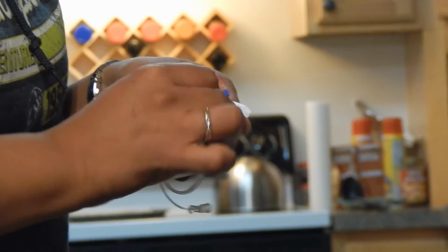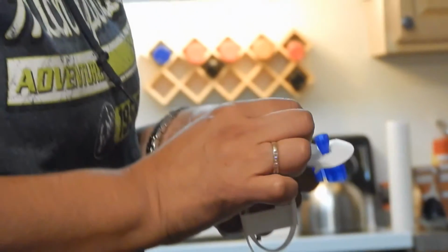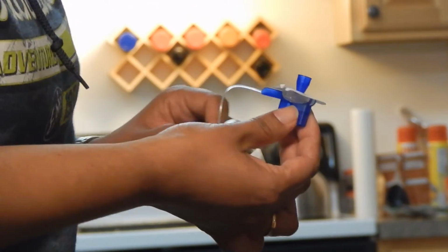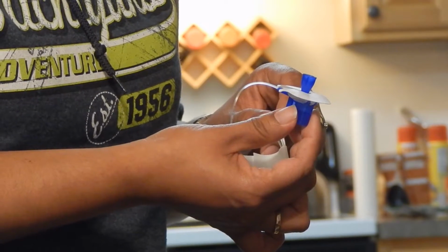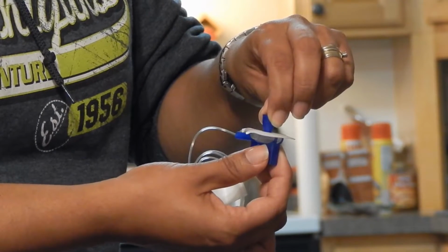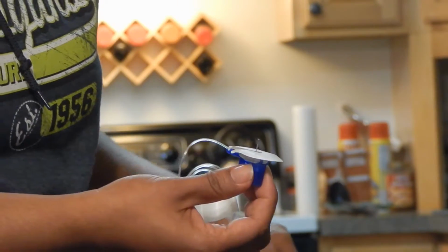Meantime, we separate the sticker to make sure that it's not so sticky, so that it doesn't hurt to take it off. Also, when the needle goes in me, they're going to take out the needle, and it's just going to be a little plastic flimsy tube inside me, so it won't hurt at all. Okay, so we need to take this cap off, in that way we can expose the needle, so that the needle won't be blocked.